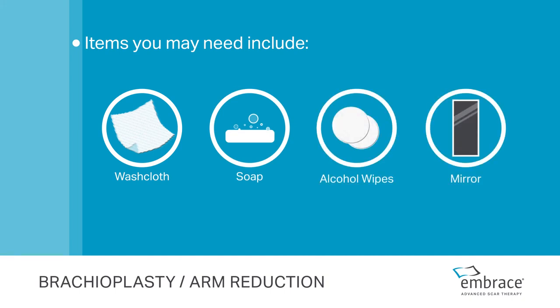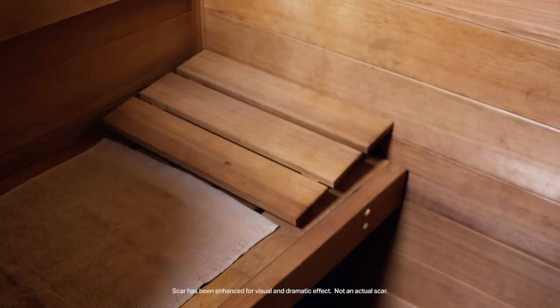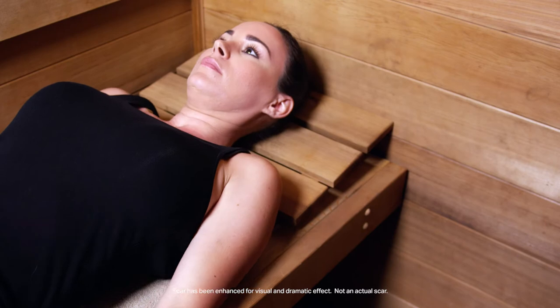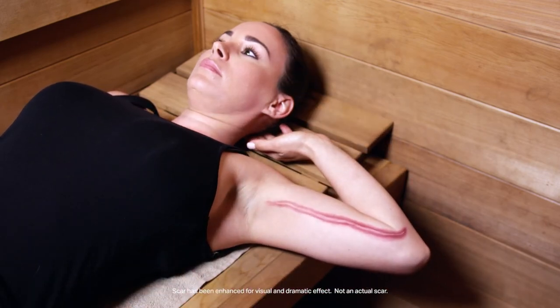You will also require assistance with application. You may be most comfortable lying down during application and using a pillow to support your arm. Position yourself with your hand behind your head or reach as high as you comfortably can.